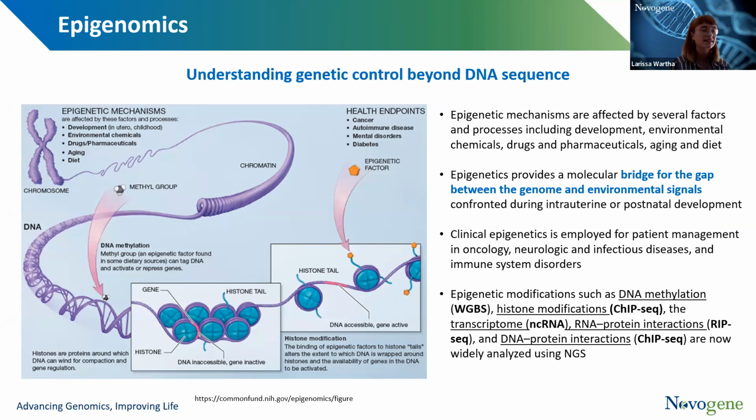So yes, as already said, if you're able to get enough material and the quality of the material is sufficient according to our requirements, which are of course adapted to accommodate that FFPE samples are generally more degraded, then we are definitely able to provide you with the same kind of results as with genomic DNA. There should be no problem about that.